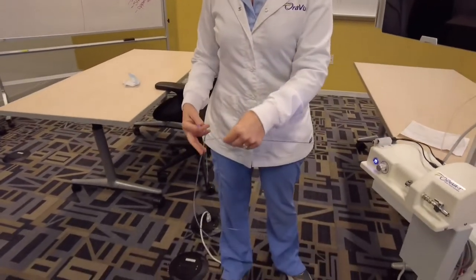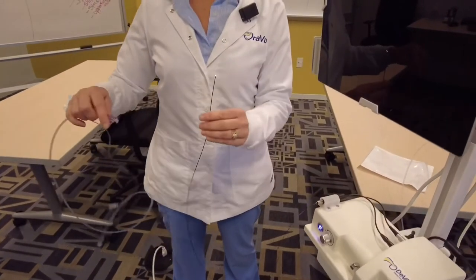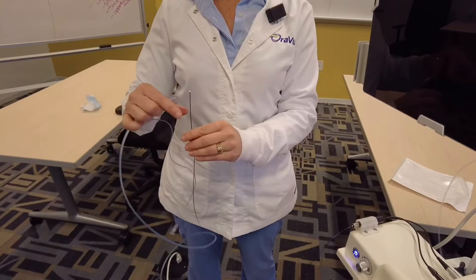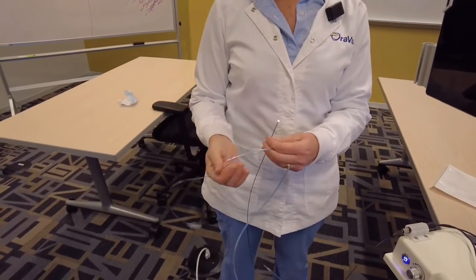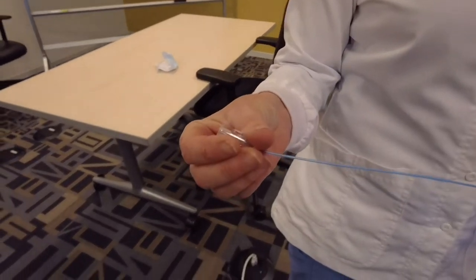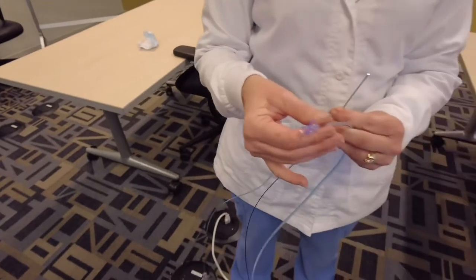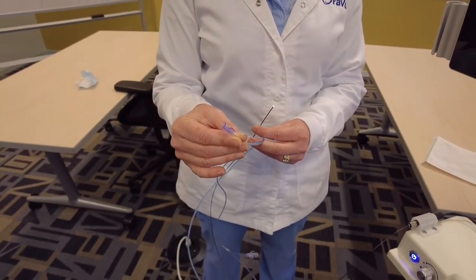You do not want to open that package until you have a patient in the chair, or just before seating your patient, to maintain sterility. There are two ends on this sheath — one is longer and it's blue, which connects to your waterline, and this other end is what you would thread your fiber into.